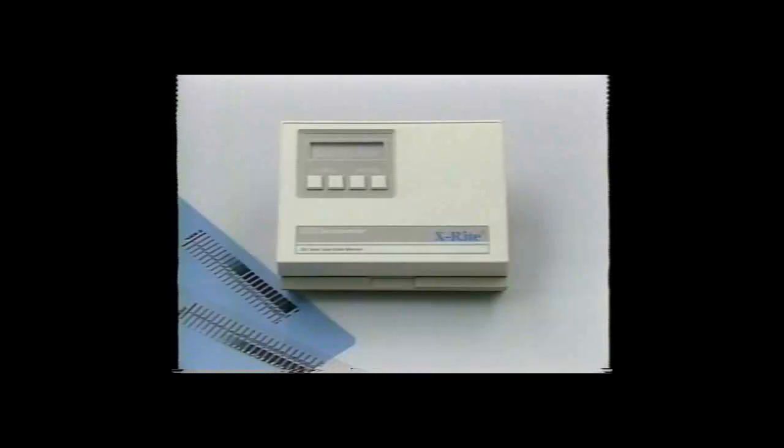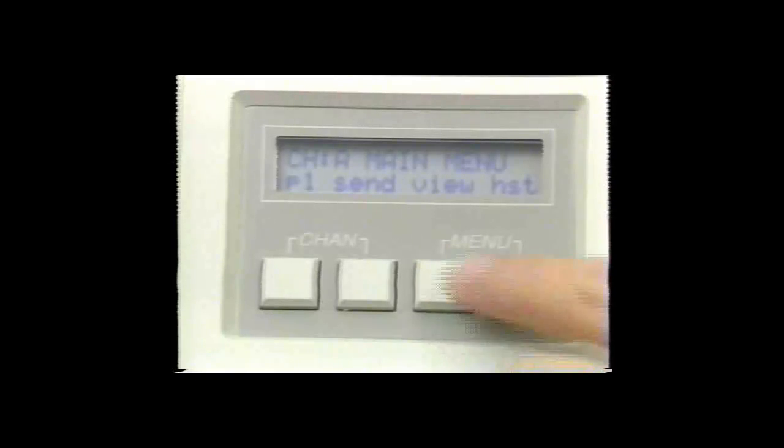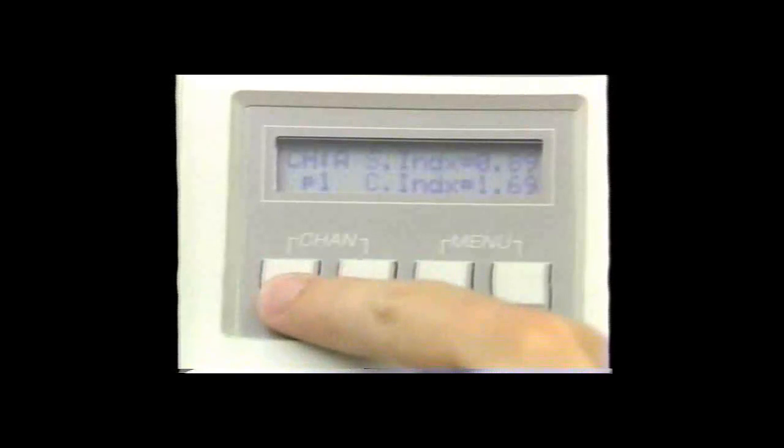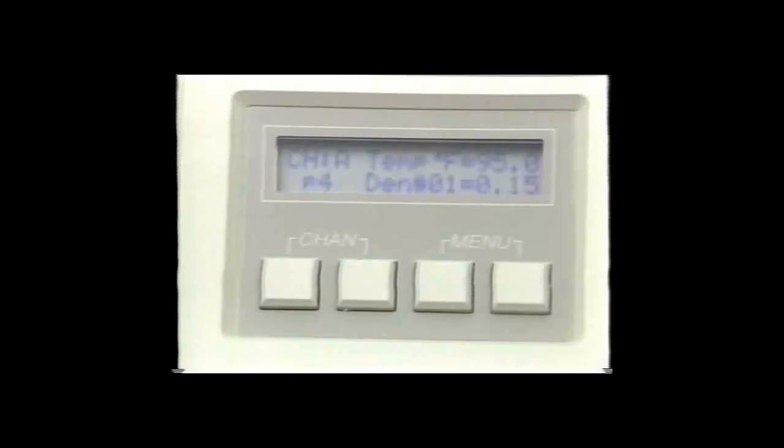There are several ways of looking at the information once the 381 has read the strip. To view the calculated data, simply push the view button. You can then sequence through all six parameters or the density values for all 21 steps. Pressing the send and plot buttons produces a report listing five film parameters plus a D-log E curve — a plot of the density value of the film for each exposure step.